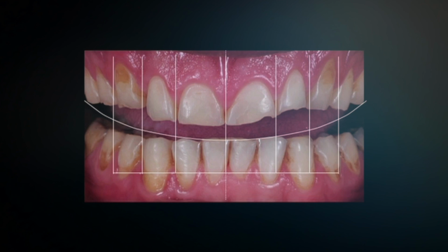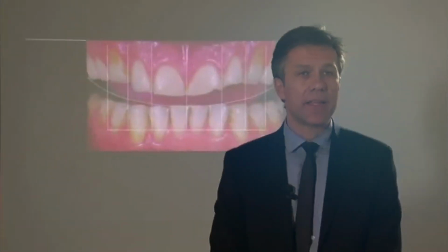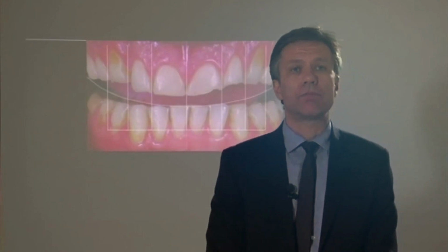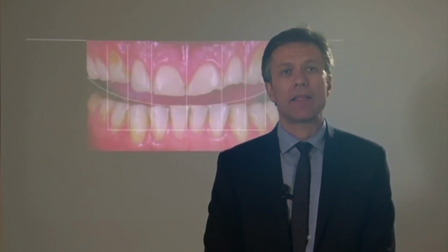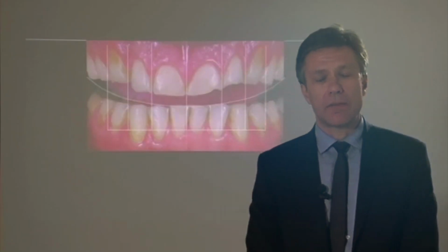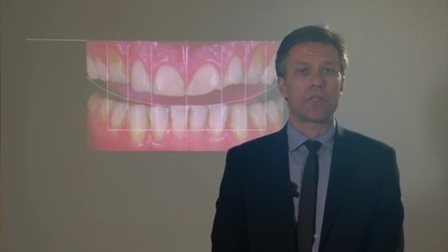Here we can see the case. I usually do some drawings. They help me to evaluate the case. They help the technician and me to plan the correct position of the teeth. How can I increase the incisal length? How can I manage the occlusal plane? And of course, it will be tested. Eventually, it will be tested in the mouth, and from that point, we can develop our treatment plan.